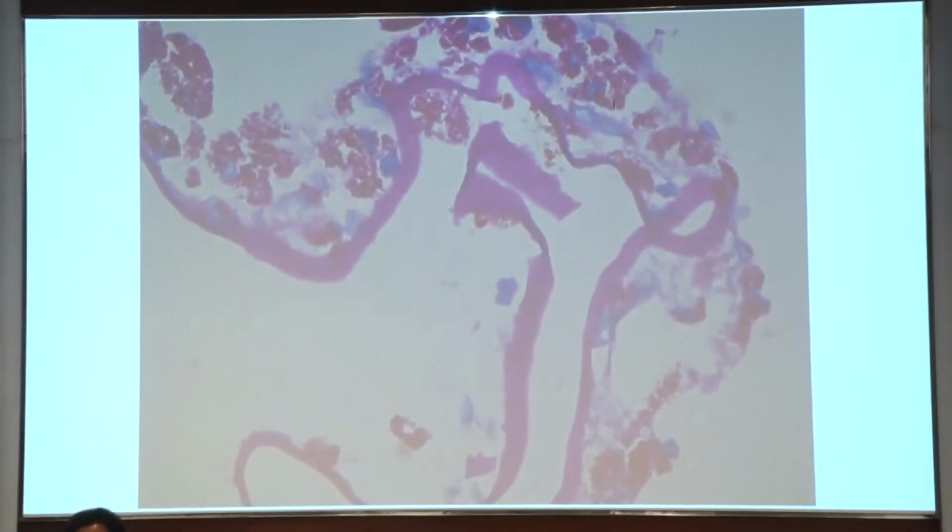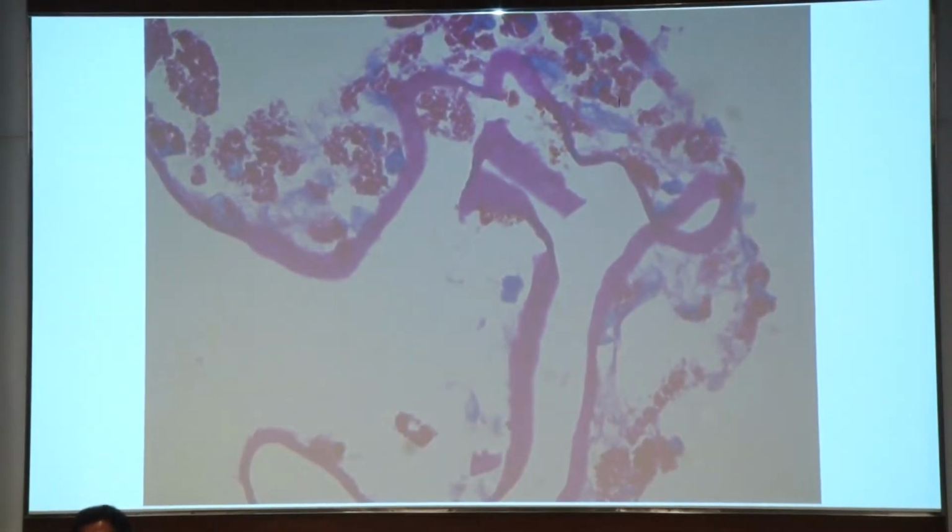the hypothesis that idiopathic epiretinal membrane can have an inflammatory component. More importantly, whenever we peel epiretinal membranes, there are cases where the vision is actually worse than the baseline visual acuity when we started off the surgical planning. There is an increase in the edema on OCT in the first few weeks, and the visual acuity can drop postoperatively before it starts recovering. Various studies have shown inflammatory cells in peeled epiretinal membranes as well as ILM.